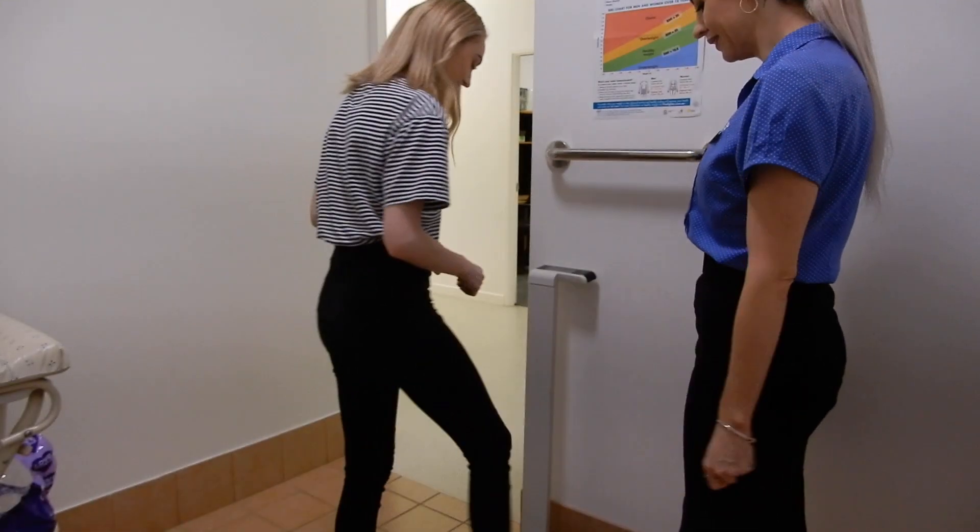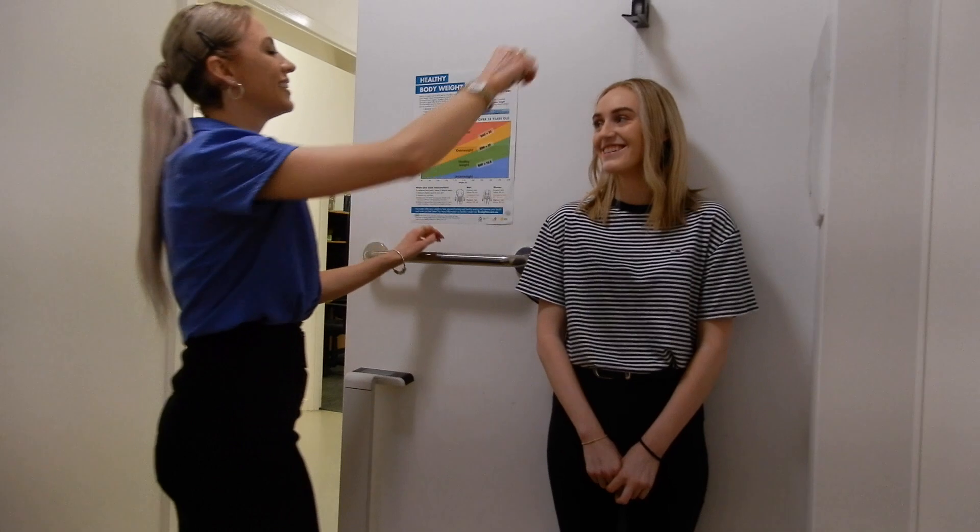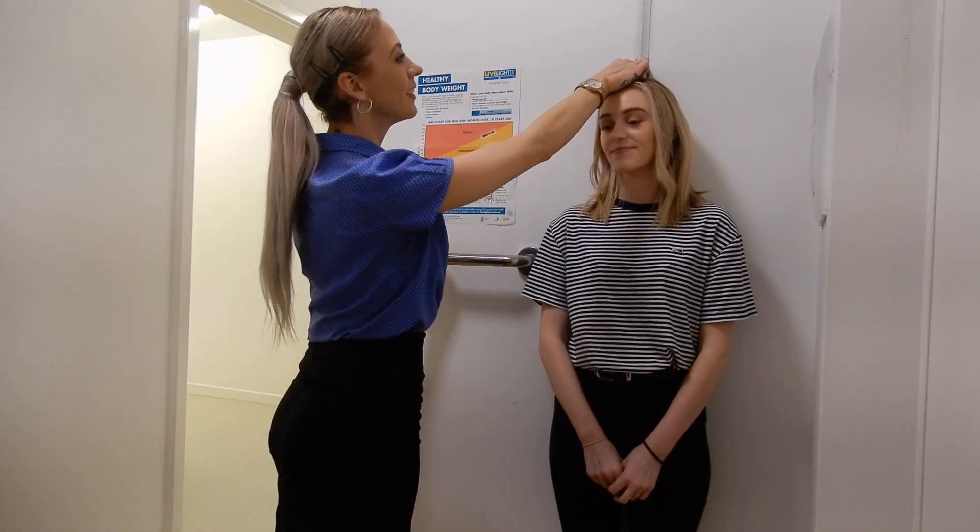Spirometry is designed to test your lung function. If at all possible, your doctor will probably advise you to try and remember not to take any of your usual inhalers or other medications that will affect your breathing on the day of the exam, because these medications can impact the results of the spirometry test. A current height and weight along with your smoking history are required to enter into the software program, which helps to determine your predicted values for the test.